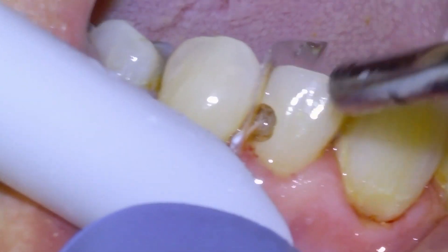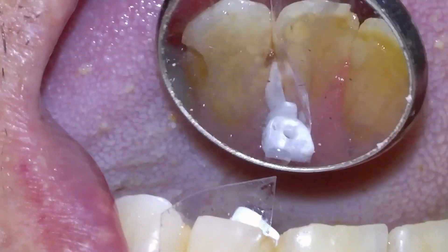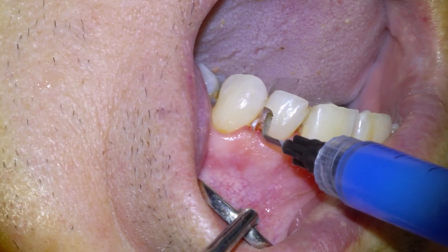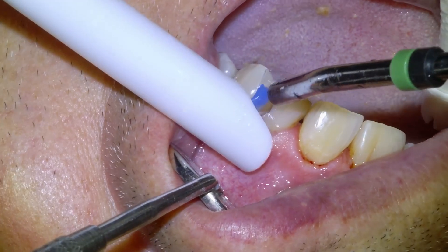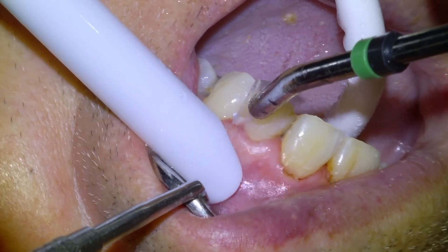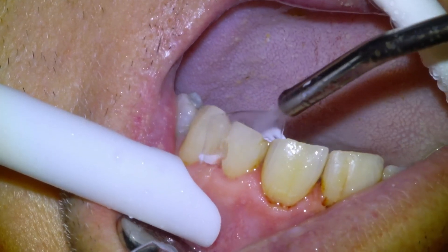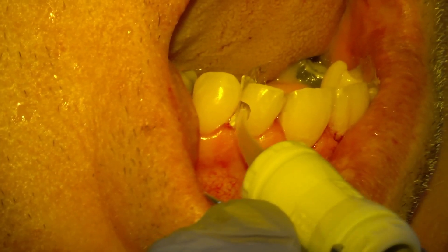Before we can place our dental filling material we actually have to condition the surface of the tooth to basically clean it, so that we have a strong bond between the tooth and our filling material. We're going to use this conditioner — this blue gel — that sits on the tooth for just five seconds, which kind of dissolves all of the surface impurities, and then we're going to rinse it off and dry it a little bit.